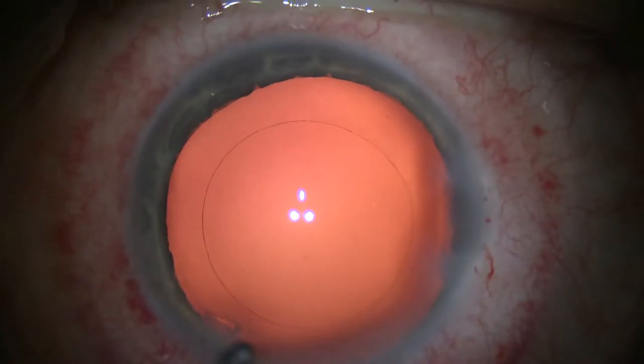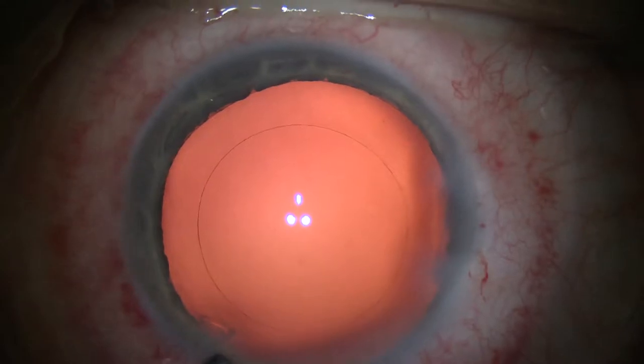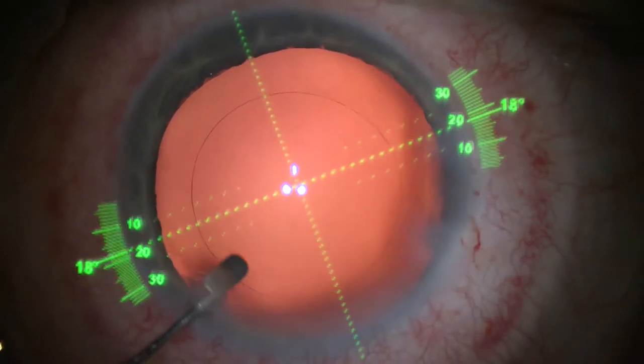Hi, this is Steven Slade with a new video showing a toric lens for astigmatism and presbyopia, as well as a guidance system to place that lens properly.